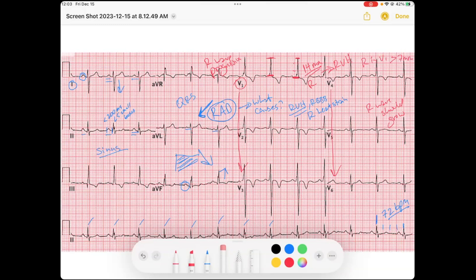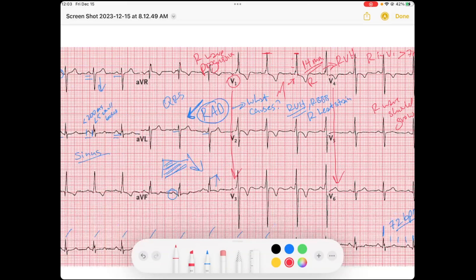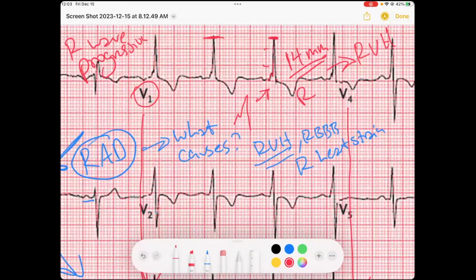Also, looking at the QRS in this lead, you can see almost an RSR' pattern. We'll zoom in — you can almost see it as RSR'. However, the QRS duration is narrow, so we know this is not a right bundle branch block, but rather we could say maybe it's an incomplete right bundle branch block. We've confirmed right ventricular hypertrophy, perhaps with an incomplete right bundle branch block.